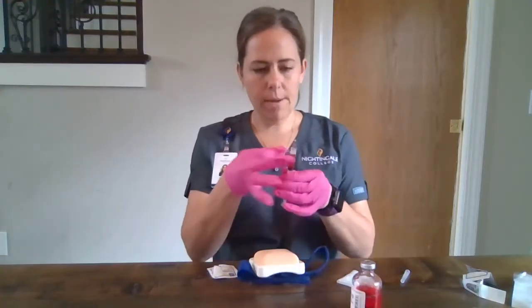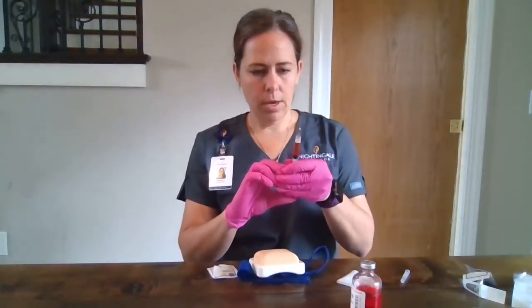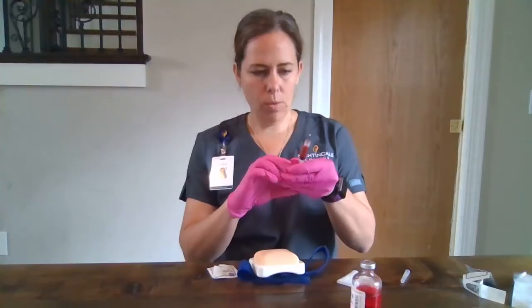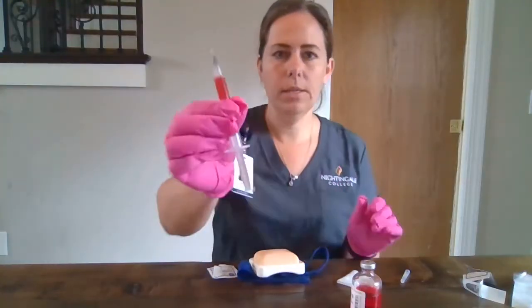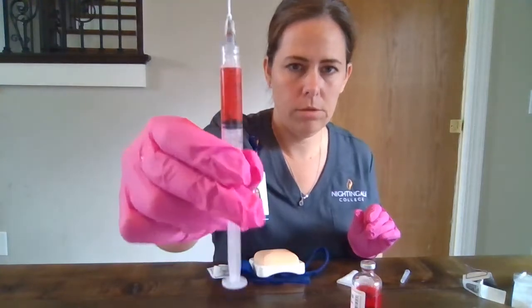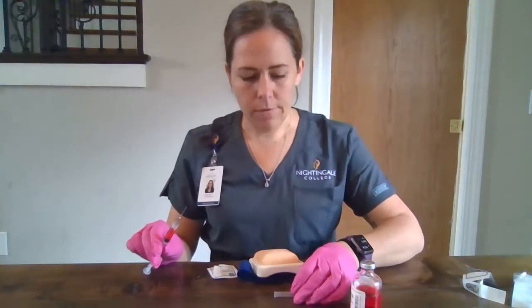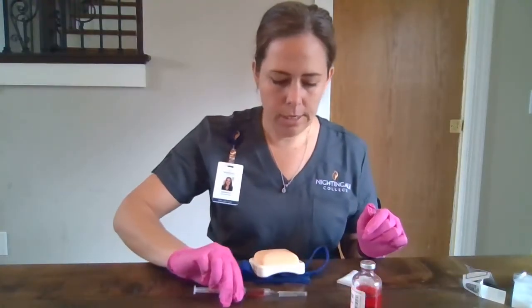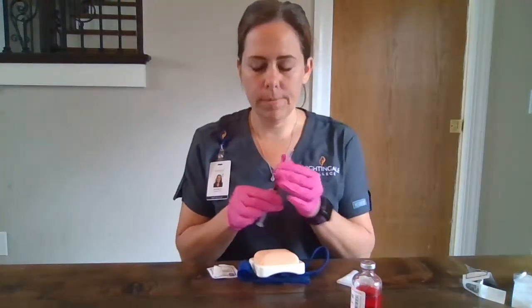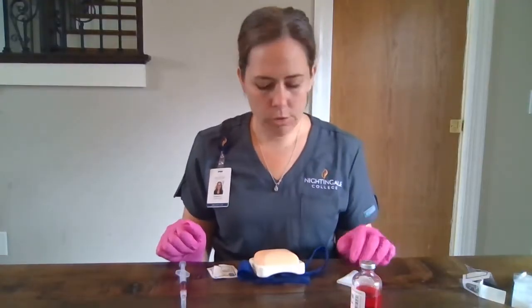All right, we're going to tap for any air bubbles and ensure that we are at our 1.5 mLs. So here is our 1.5 ml dose. We are going to safely recap our syringe, our needle. If we have withdrawn this away from the patient, then we will label it with our medication and our dosage.